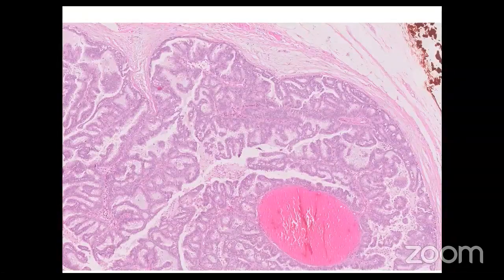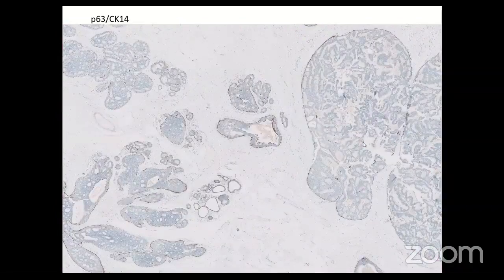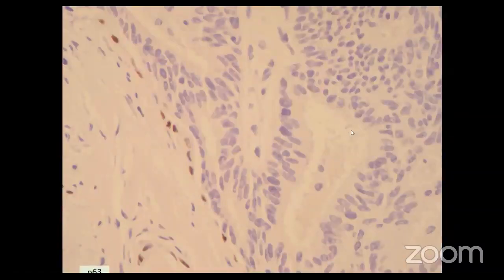An illustration of papillary DCIS in which there are papillary structures covered by a uniform appearance of epithelial cells that distend this affected duct space. On immunohistochemistry, myoepithelial cells are preserved at the periphery of the affected duct, but appear to be absent throughout the papillary structures themselves.